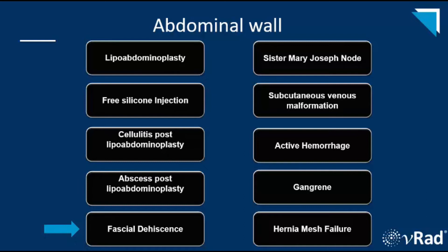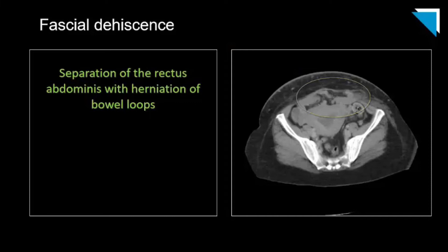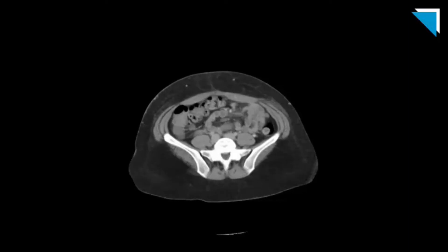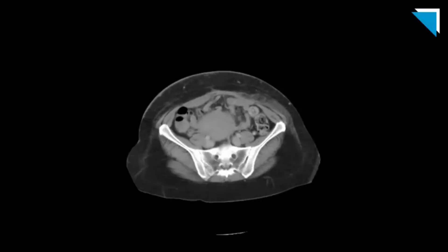Moving away from cosmetic procedures and on to obstetrics briefly. In this single axial image from a contrast-enhanced CT scan in a patient with recent cesarean section, we see separation of the rectus abdominus muscles with herniation of multiple loops of non-distended, non-obstructive small bowel through the abdominal wall defect, compatible with fascial dehiscence. The full image shows the extent of the rectus abdominus separation in the midline at the level of the linea alba.